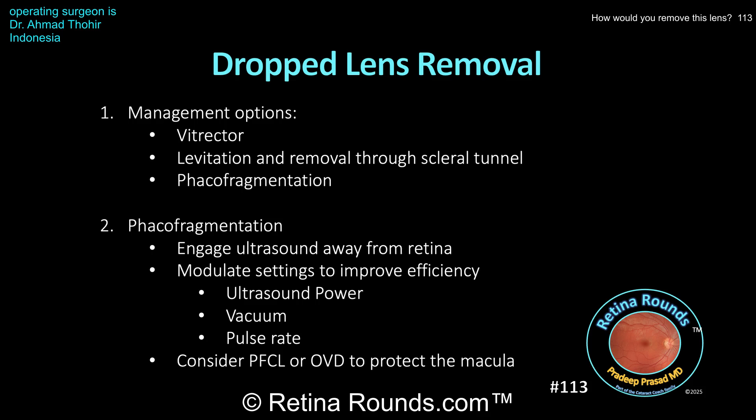A couple of other tips when using the fragmentome: just as Dr. Tohir did, aspirate the lens material and bring it up into the mid vitreous cavity before engaging the phacoemulsification — this helps prevent iatrogenic damage to the retina from the ultrasound energy. Remember that you have a number of parameters to improve efficiency: if the fragmentome isn't cutting the lens material, increase the ultrasound energy; if the lens material isn't folding into the frag handpiece, increase the vacuum; and if the lens material has poor followability or is being propelled away, use a pulse mode and decrease the duty cycle to give more opportunity for aspiration between periods of emulsification. Since material can break into sharp fragments that may damage the retina, consider protecting the macula with either PFCL or a dispersive viscoelastic agent, keeping in mind that these substances can also trap lens fragments and make them more difficult to remove.